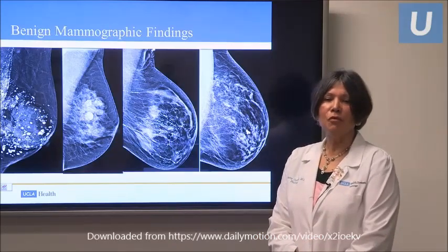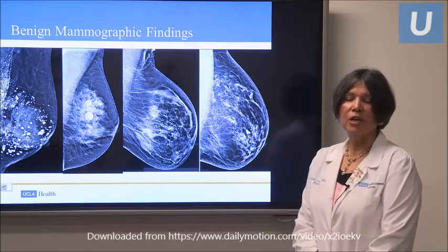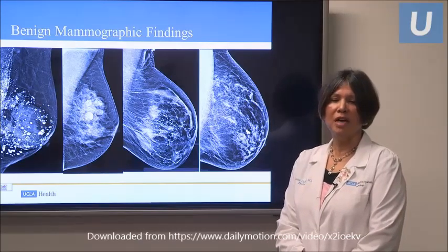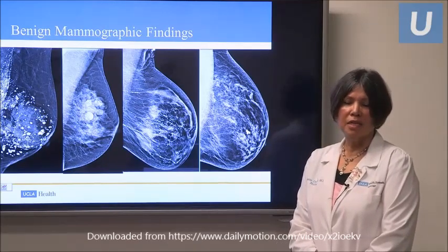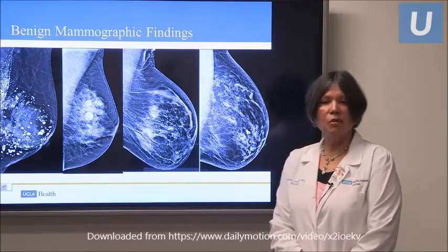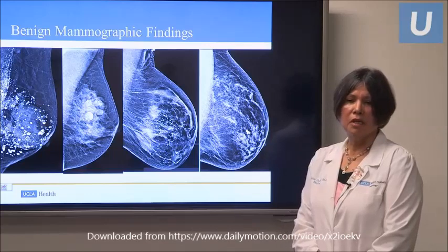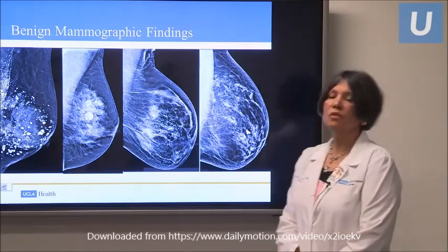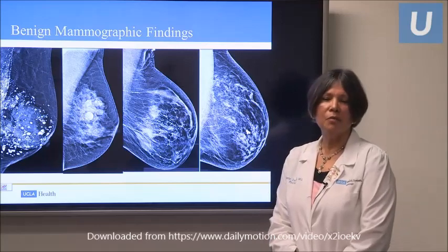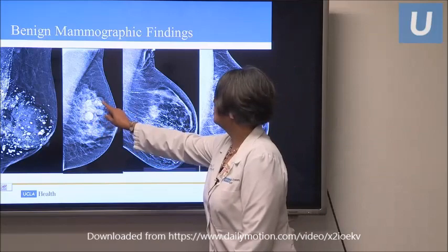Now, to give you an idea of what I see every day, these things look pretty scary in here, but these are benign calcium deposits. On the far screen is a woman who had silicone injections, so those very white, bright areas are residual silicone. On the next screen are calcifications of a woman who had trauma, and she developed these calcium deposits, these round circles that you see here.